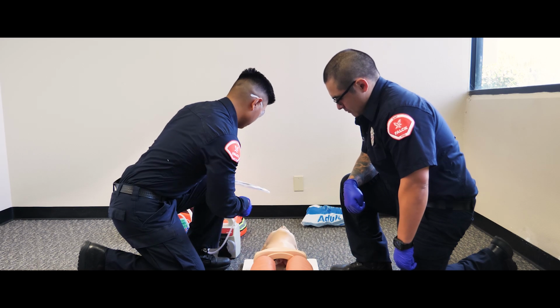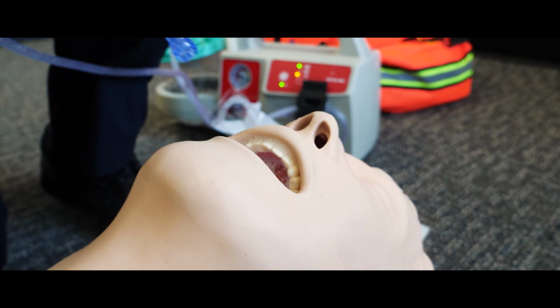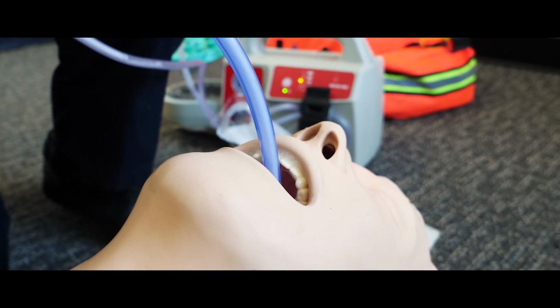The goal of suctioning is to clear the patient's airway without excessive suctioning, depriving the patient of oxygen. Suctioning longer than 10 seconds should be avoided when possible.